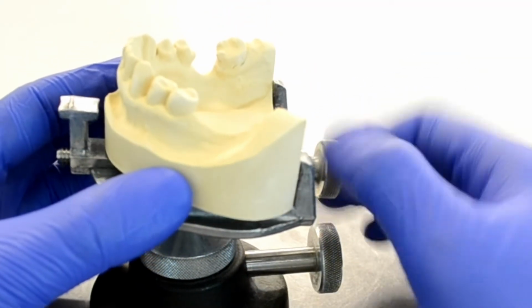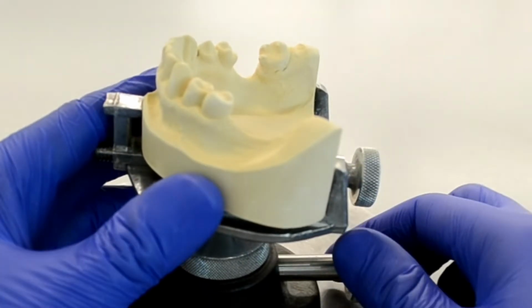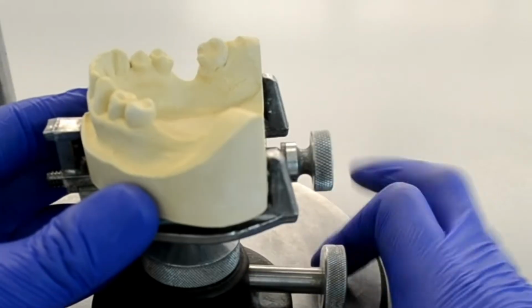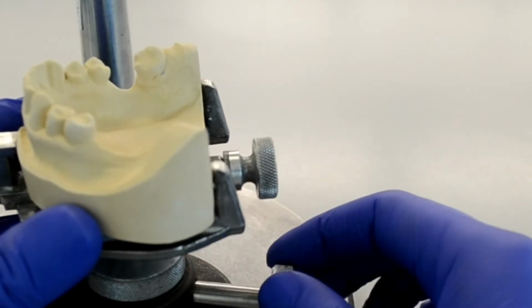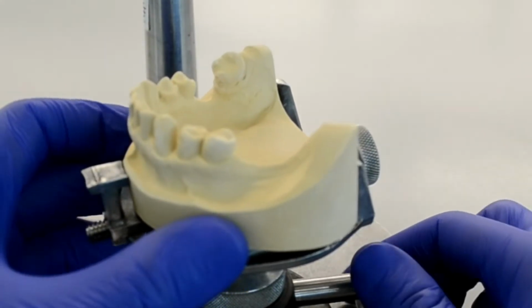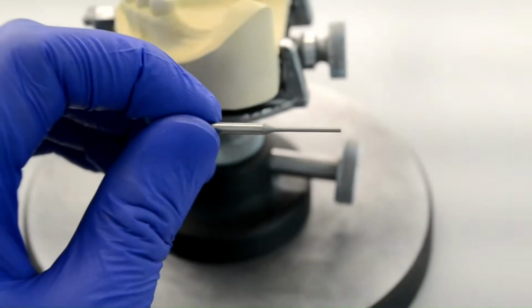We will start by securing the cast onto the table. We also want to make sure that the occlusal plane of the cast is fairly level with the horizon. The first step of surveying is to analyze the cast. This is done using the analyzing rod, which looks like this. We'll go ahead and put that into the mandrel.